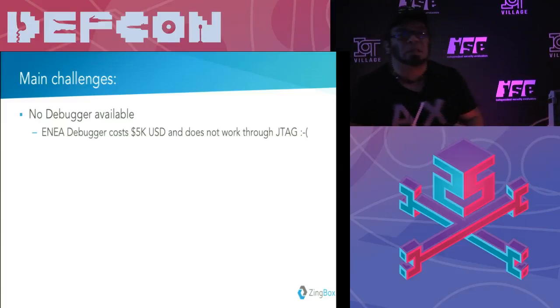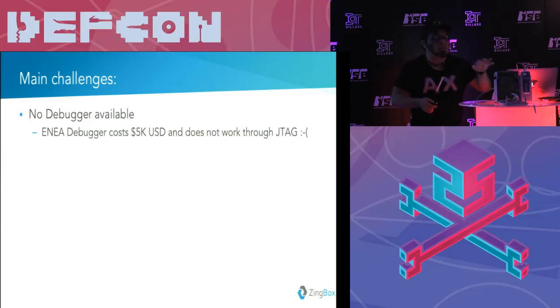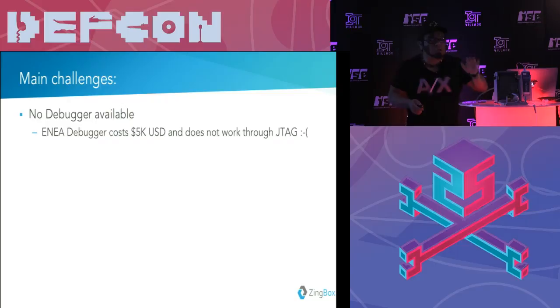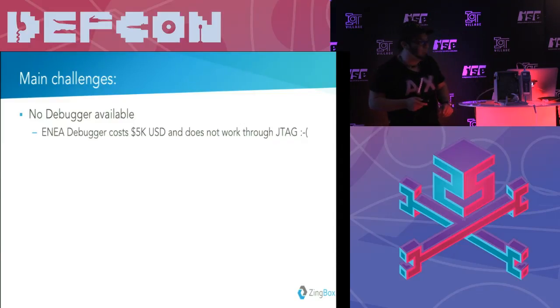Okay, main challenge. It's very important to mention that this is a black box, we just got it in the package, we don't know what it is. We started working on it and realized that in order to interact with it, it runs a real-time operating system, I'm going to talk about that, but just to debug it, it's a $5,000 debugger. Plus, it doesn't work through JTAG, this device supports JTAG, I'm going to talk about that, but in order to interact with it, you need to have an Ethernet connection to the board, and it costs $5,000. Even with this, we cannot interact with the debugger that is developed by ENEA.